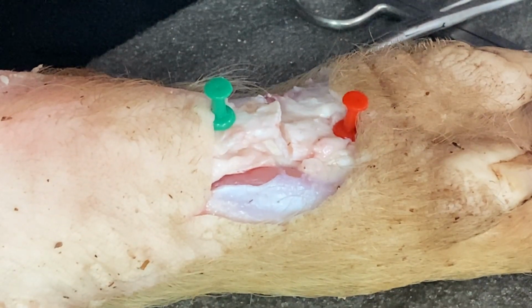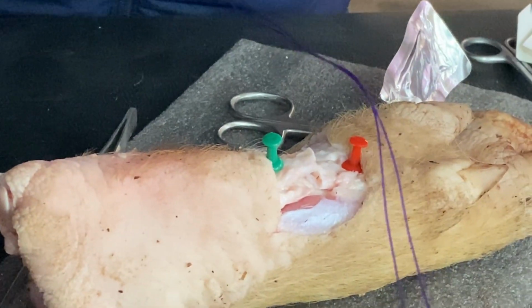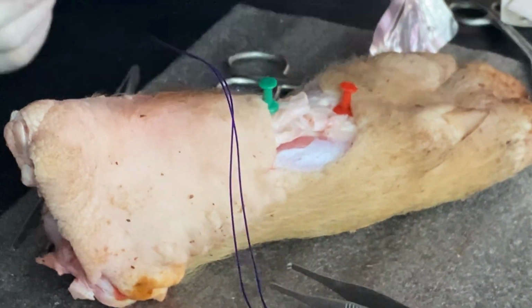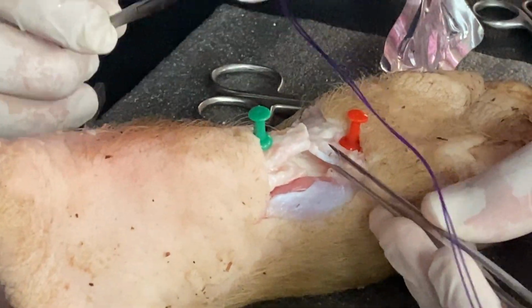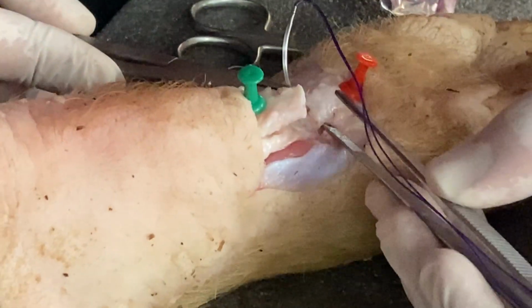Repair is very easy. First of all, we don't use tooth forceps. We use blunt forceps. And then we use the cut end. Okay, can you see this? We will try to insert it through the tendon substance.